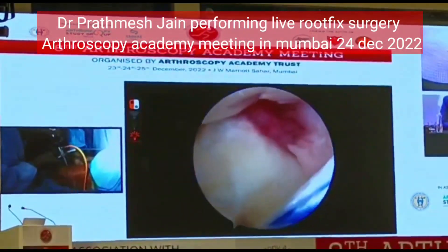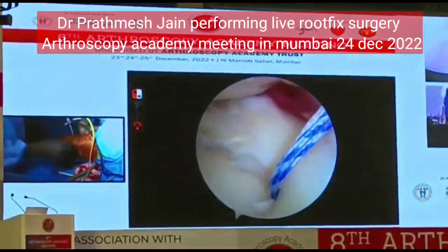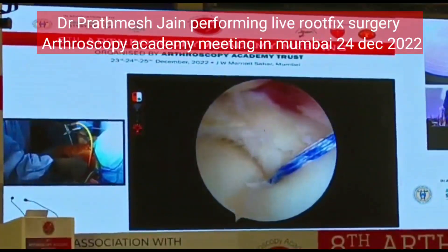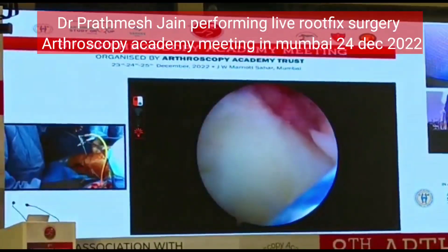Professor Sanjay here. Sir, immediately behind the angle you will see that the quality is not that good, so you will be getting a good hold of the cortical bone. The hold is good. We can pull it and see again. The hold is usually good — it is cortical bone.